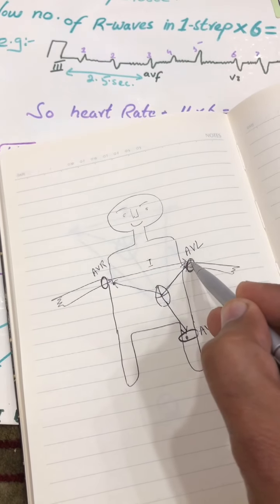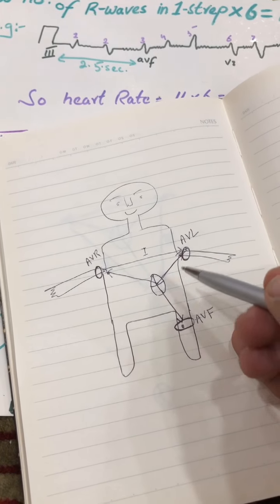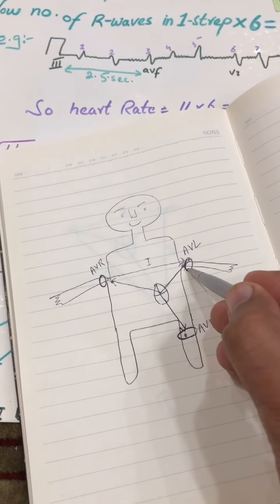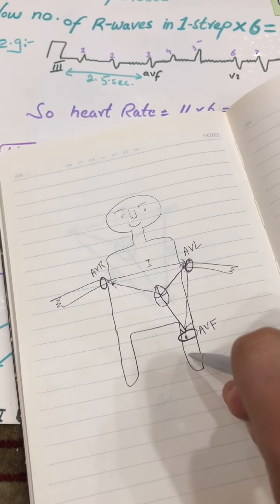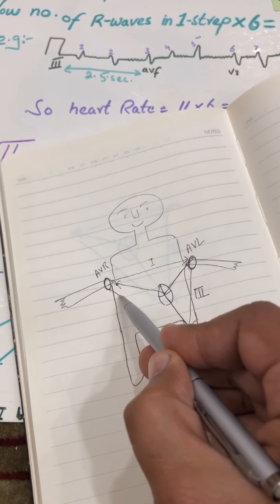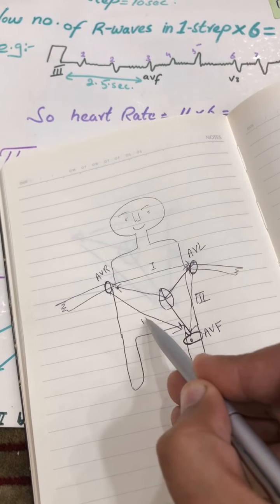Now, the final thing that we are going to do is connect all these leads and put it over here. Now we're going to connect this lead AVL with the foot, that is AVF, and this is known as lead number 3, and we're going to connect this to the foot lead, and this is known as lead number 2.